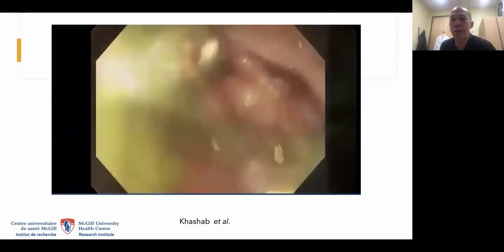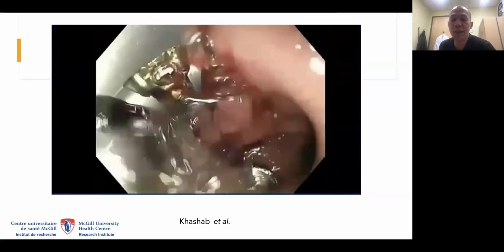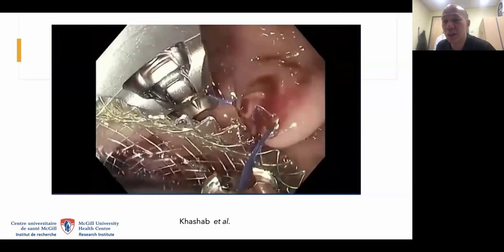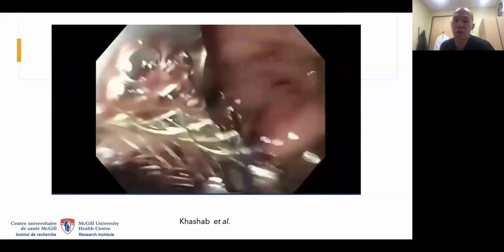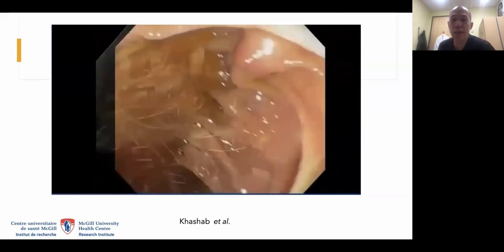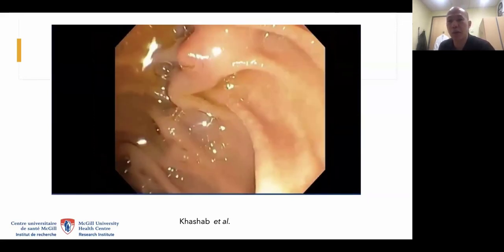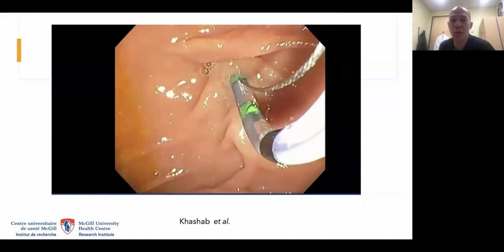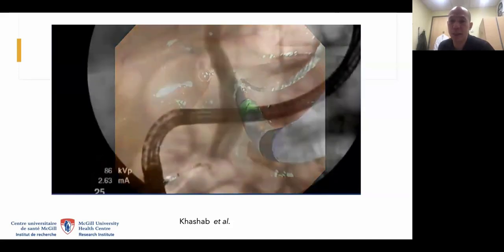In Montreal, because we don't have the suturing device, and in the States they do, they suture the stent to allow for same session ERCP. In Montreal and McGill right now, the current practice is to wait 2 weeks to allow the tract to mature in case we displace the stent. We then go in, this is a regular duodenoscope, and perform ERCP in a regular position.